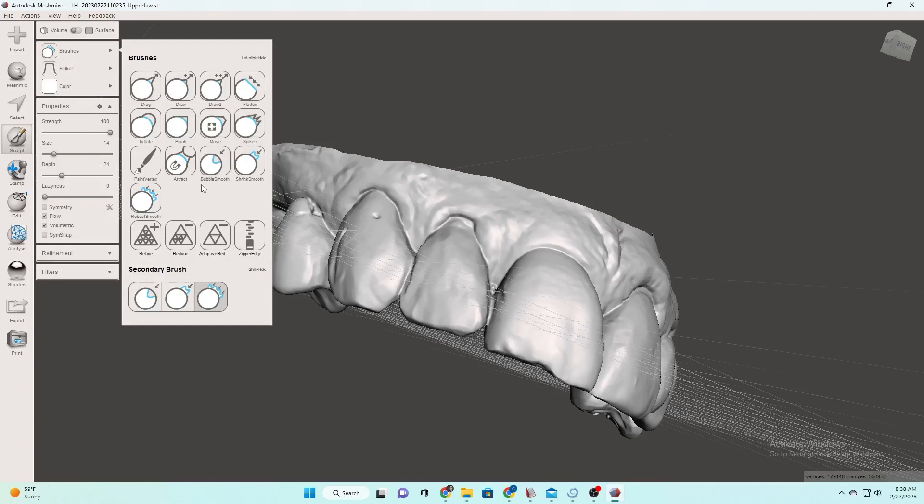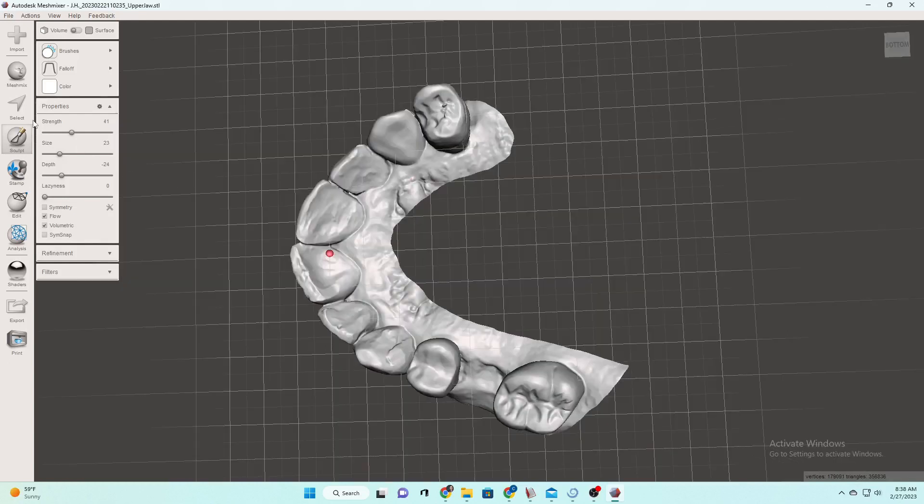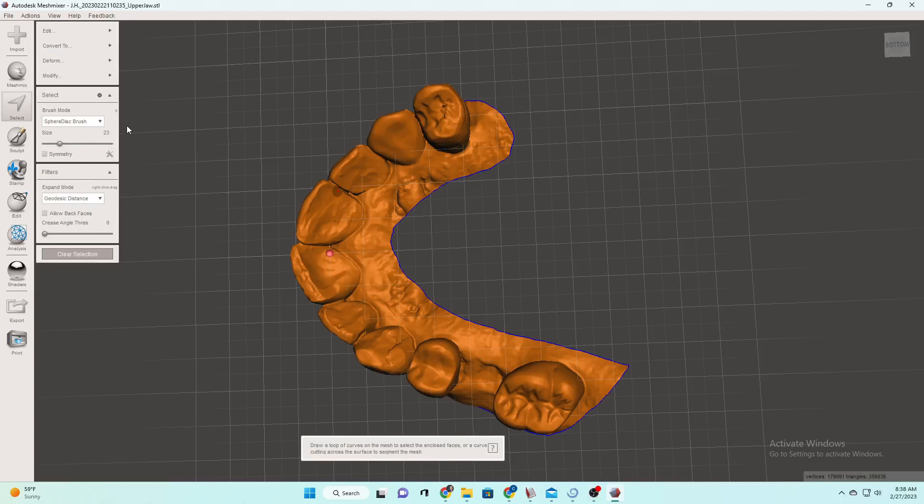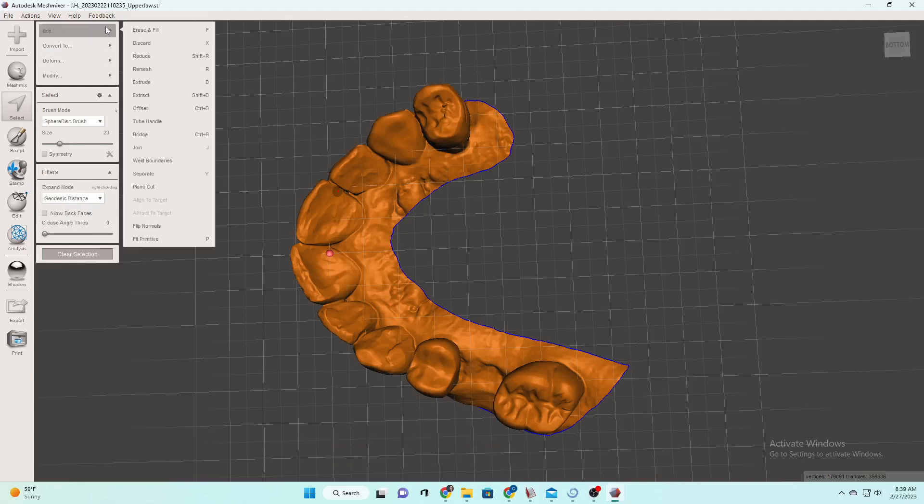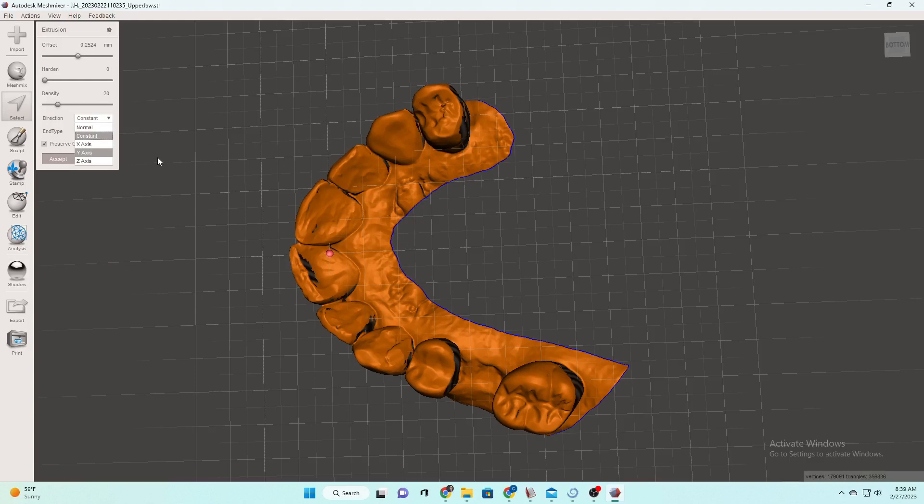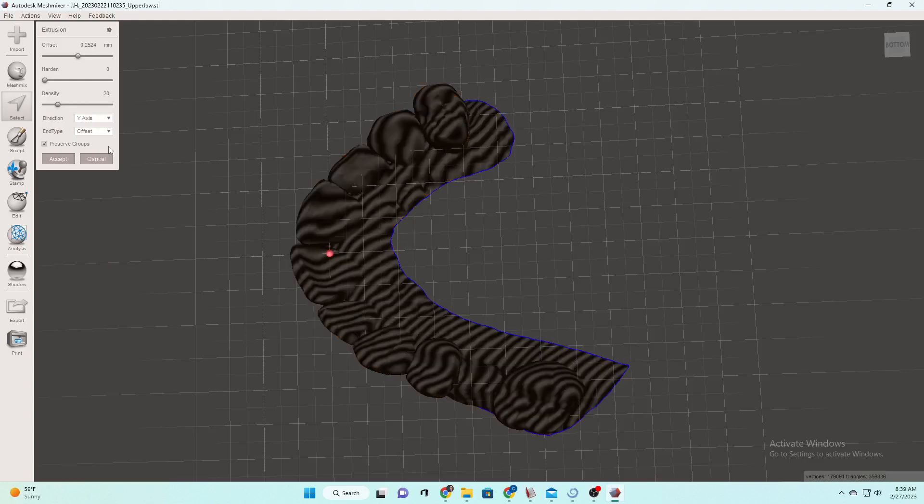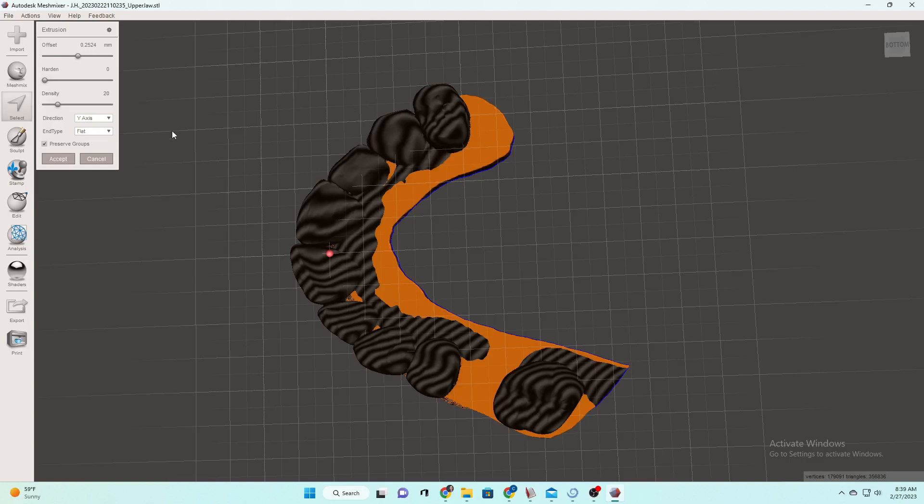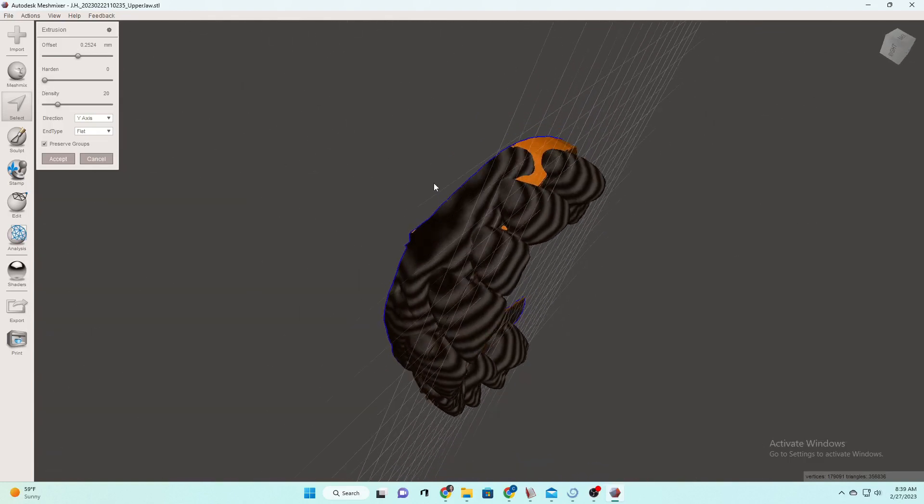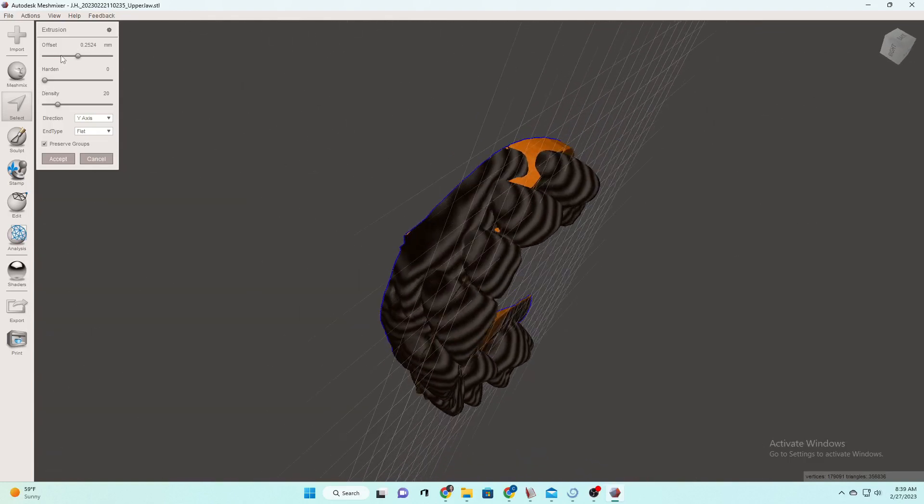Then what we're going to do is we are going to go to select. Then we will control A to highlight all of it and we're going to go down to extrude. This is putting the base on the model for us. We're always going to go up here and change it to the same settings, the y axis and flat.